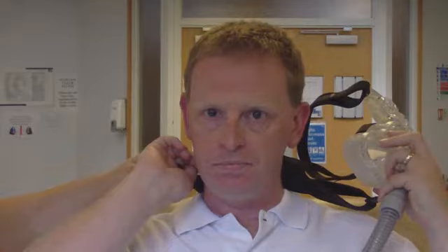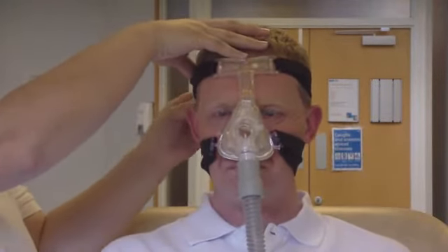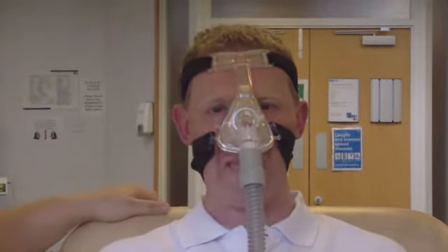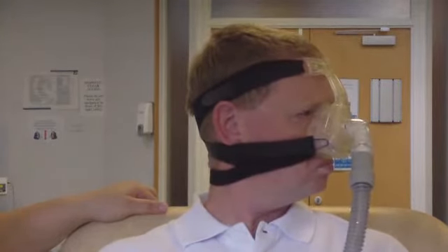or feel claustrophobic. So now we see a nose mask in situ, a very similar shape mask, but it just goes over the nose, and the mouth is open and the patient can talk and drink. Okay, if you look around the head, there's a very similar mechanism for holding it in place.